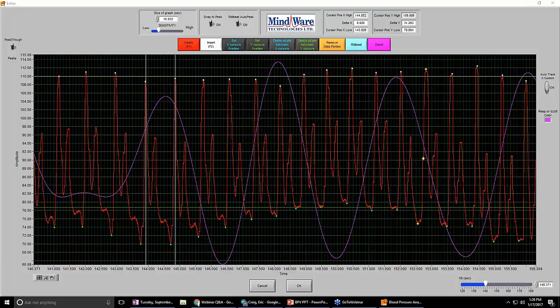So basically, throughout all of your data, if you're editing or having to extrapolate more than 10% of the data for the entire file, so for the entire segment and for the entire file, then you would probably want to consider throwing that subject's data out.